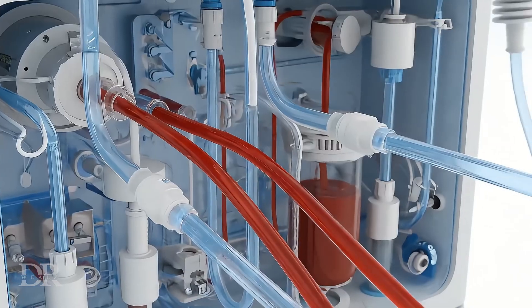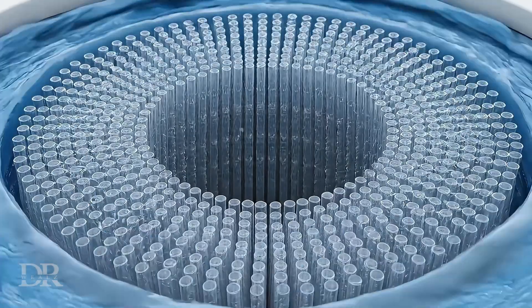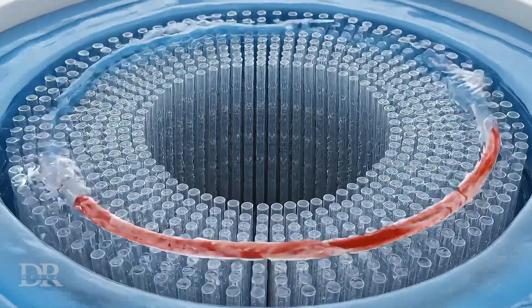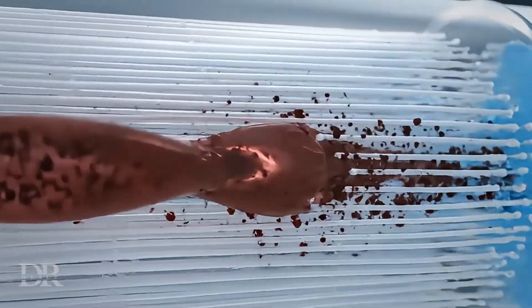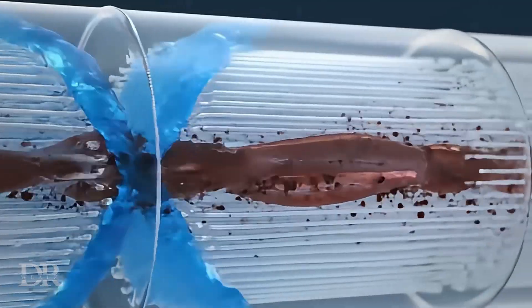The blood flows through a dialyzer, a cylindrical filter with thousands of hollow fibers. These fibers have semi-permeable membranes that allow small waste molecules and excess water to diffuse into the dialysate solution, while keeping larger cells and proteins in the blood.